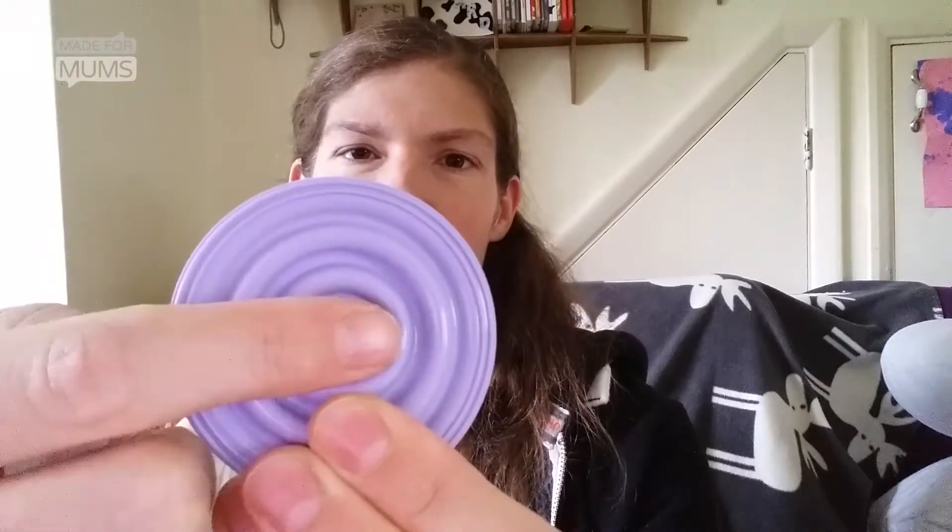I didn't realise this when I first expressed, but you need to put the diaphragm the arrow side up — you can see it's got a little arrow in the centre there. It needs to be that side up, otherwise your kit won't work.